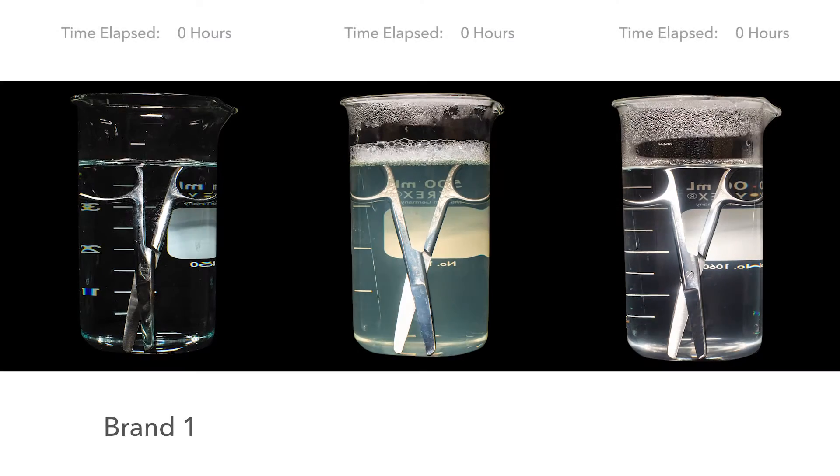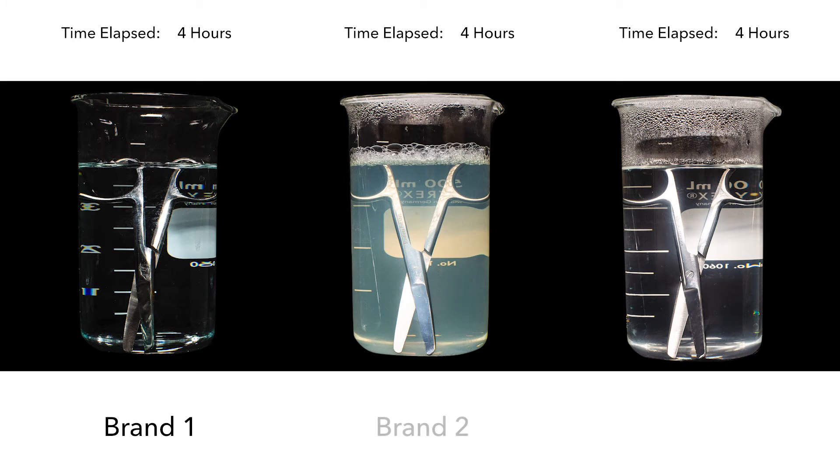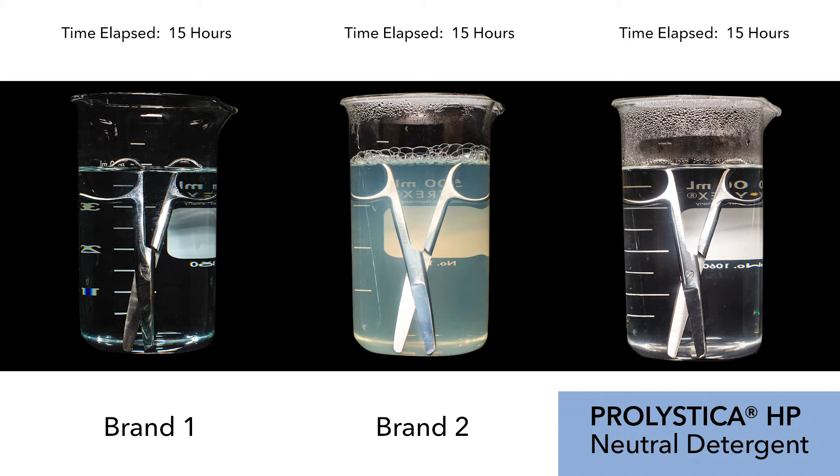To demonstrate this, I'd like to show you a time-lapse of surgical scissors that we've placed into three different chemistries. On the left you'll see brand one, followed by brand two in the middle, and finally Prolistica HP neutral detergent in the beaker on the right.